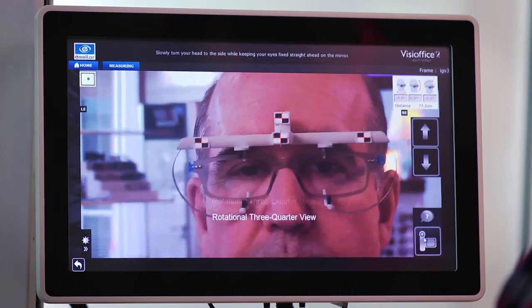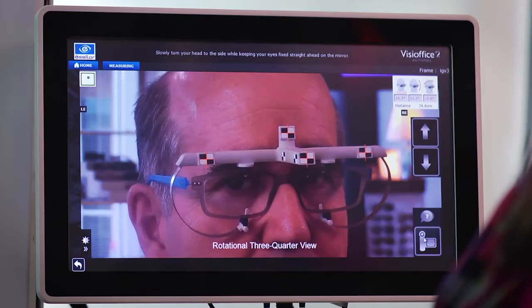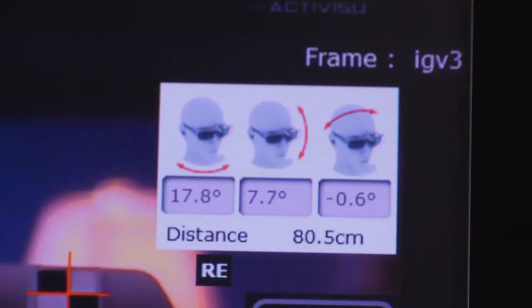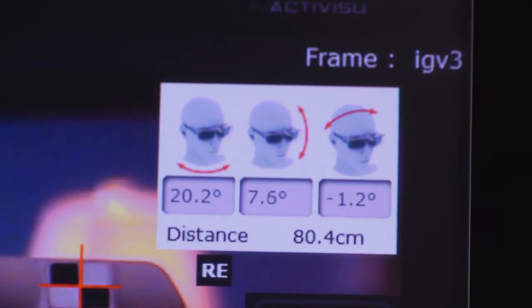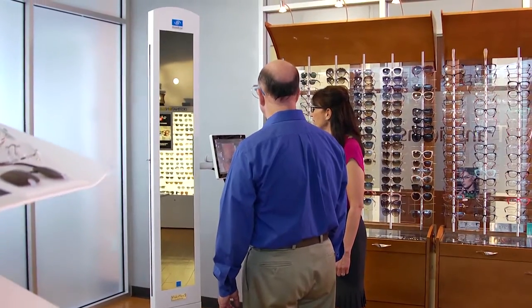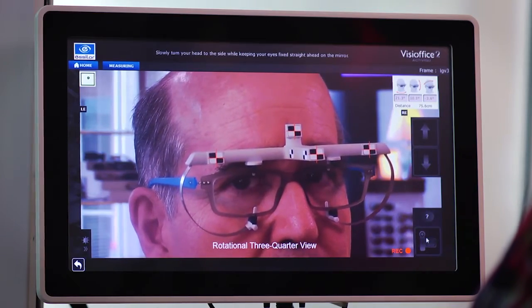Now you'll take the next photo, the three-quarter view. Slowly turn your head to the side while keeping your eyes fixed straight ahead into the mirror. Ask the patient to slowly turn their head to the side. The first box in the top corner of the screen needs to show they've turned their head between 15 and 25 degrees. Once their head is within range, have them look at themselves in the mirror while keeping their head still. Select the camera icon to start the measurement.